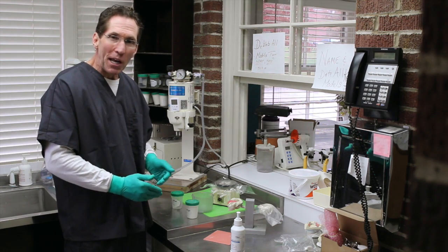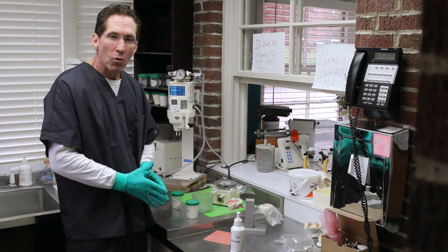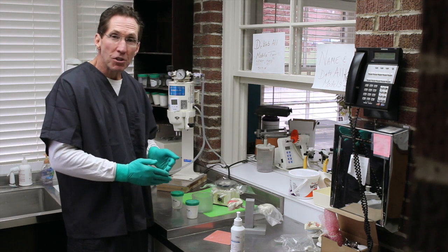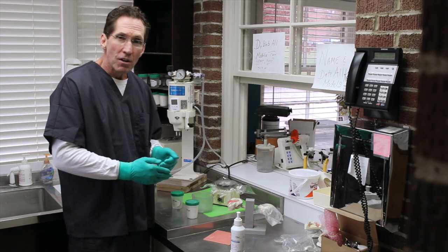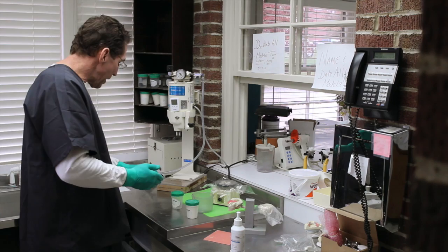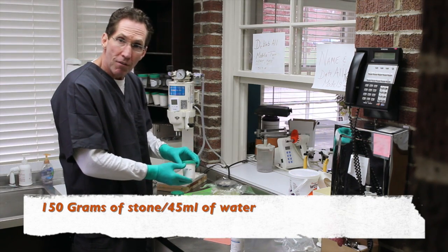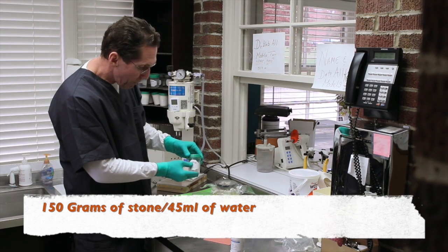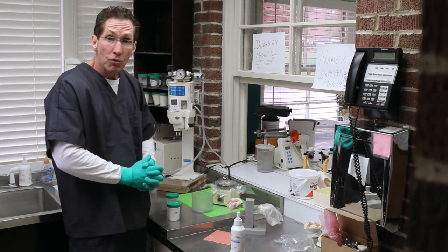Now, unlike our recommendations with the alginate, which were to make our own custom water powder ratios, the opposite is true for the stone. Here, we're going to want to have very stringent regulation of the water powder ratio by manufacturer's recommendations. And so for the purposes of consistency and also of ease, we will pre-measure, and we will use 150 grams of the powder, of the stone itself, and with pre-measured 45 milliliters of water. That is the manufacturer's recommendation.